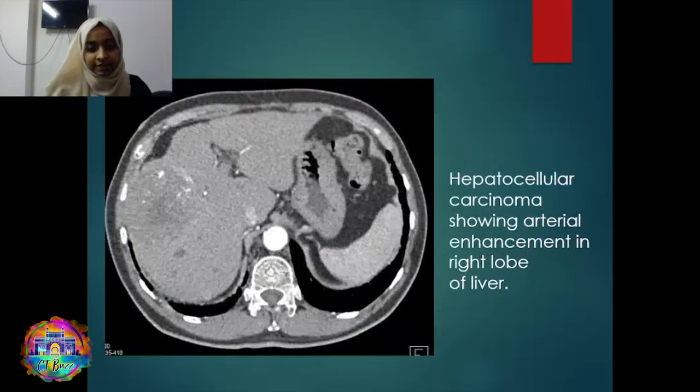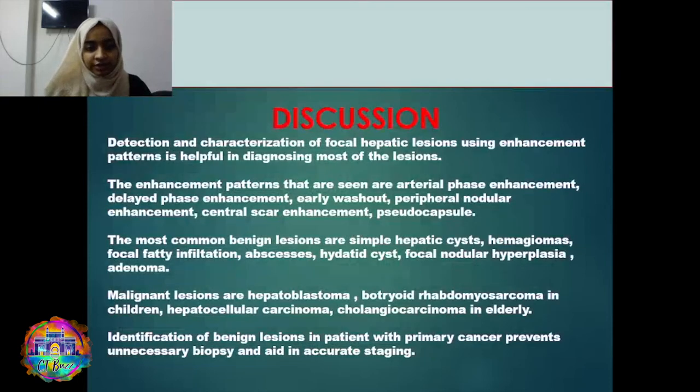This is an axial CT image showing HCC, which enhances on the late arterial phase and washes out in the portal venous phase.